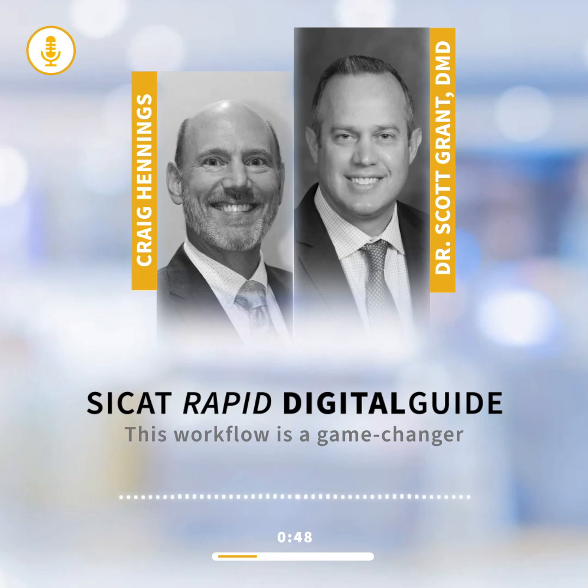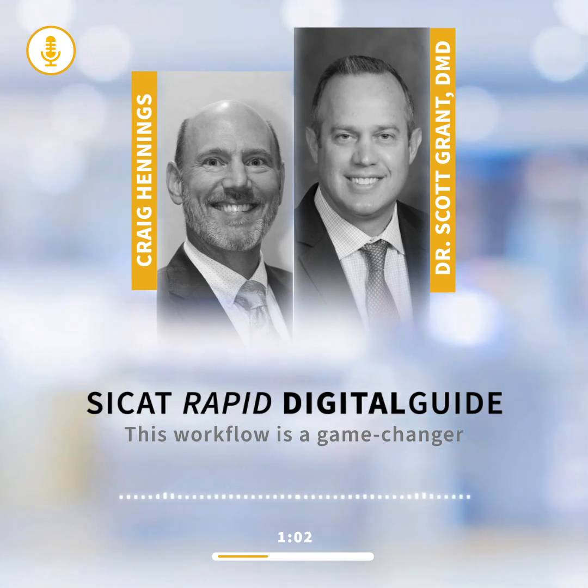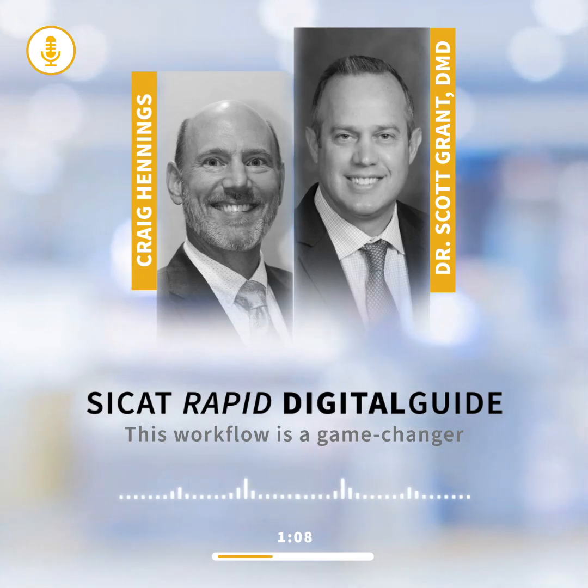And from a workflow standpoint, when somebody says they want an implant, after I just did the presentation I talked to you about, I leave the room. The team finishes everything they need to finish. They have fun saying, well, hey, this is kind of where I think the implant might be. I come in here in between patients and make my tweaks, I adjust it. That's exactly where I want the implant. I leave, and about an hour later, I'm holding that same stent, finished.